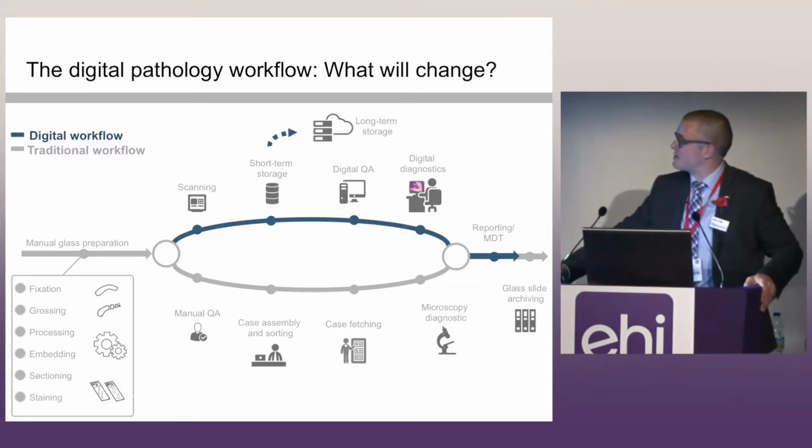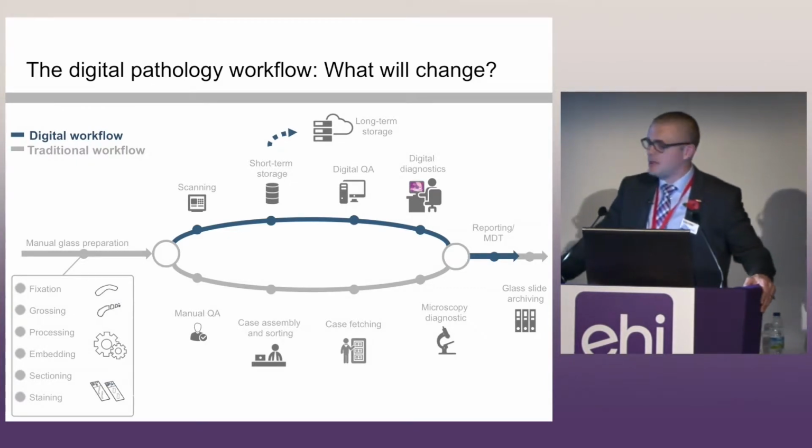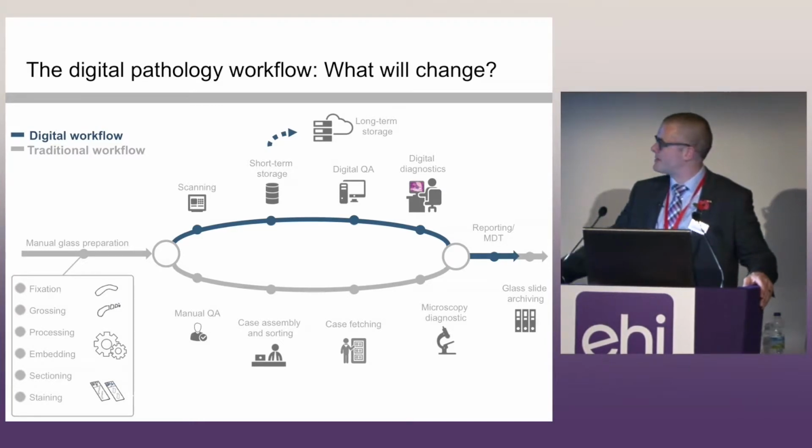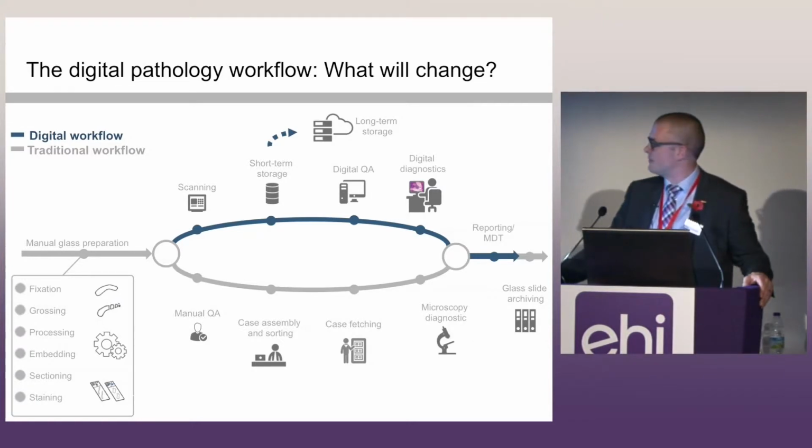If we follow the digital workflow, again you've got the glass slide preparation. However, this time the slides will be put through a scanner, where they will be automatically and immediately passed over to an archive or digital storage facility. At the same time, they can be QA'd by somebody sat behind a workstation, be it somebody sat within an office, within the hospital, at home, or even further afield, perhaps in another country.